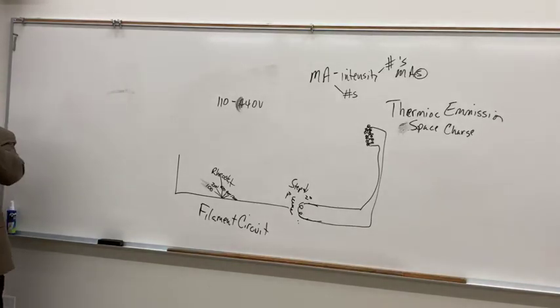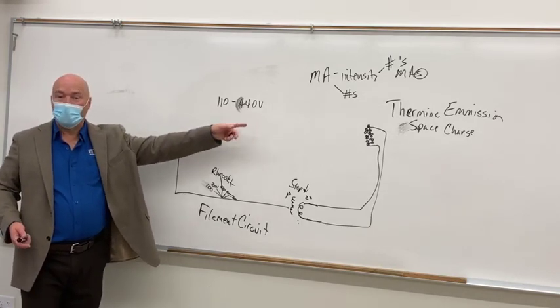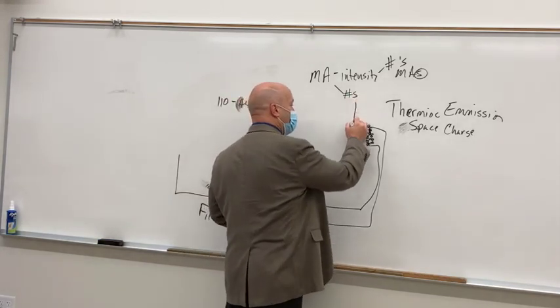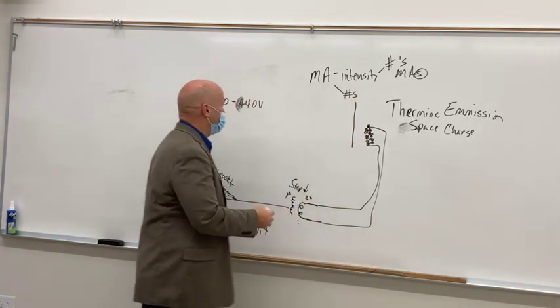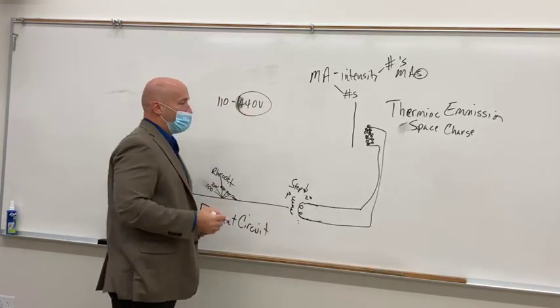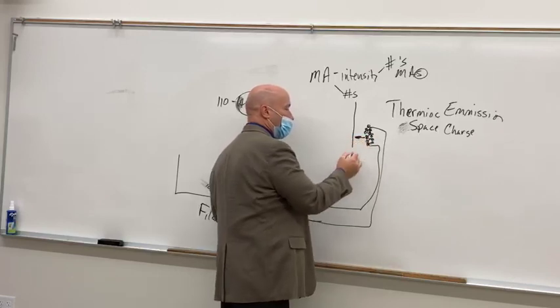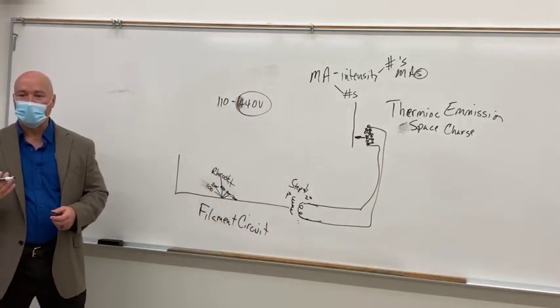Maybe not. But you get up to 440 volts, and you will. All right? So the distance between the filament and the anode itself is not very far. So if we use 440 volts in our imaging system, there's a very real possibility we're going to get electrons flow across the tube before we're ready for them to go. We don't want that to happen.